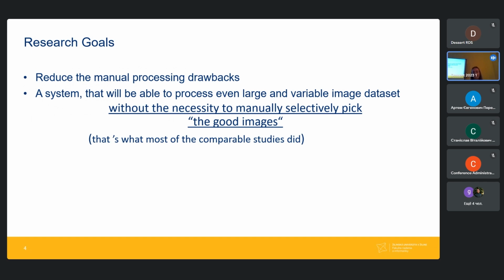Often when other researchers do image segmentation, they create their own data set. Let's say they have a data set of 200 samples, but they just decide to use the 100 samples that are very similar to each other and very clear, without any scratches or other bad things in the images, essentially.